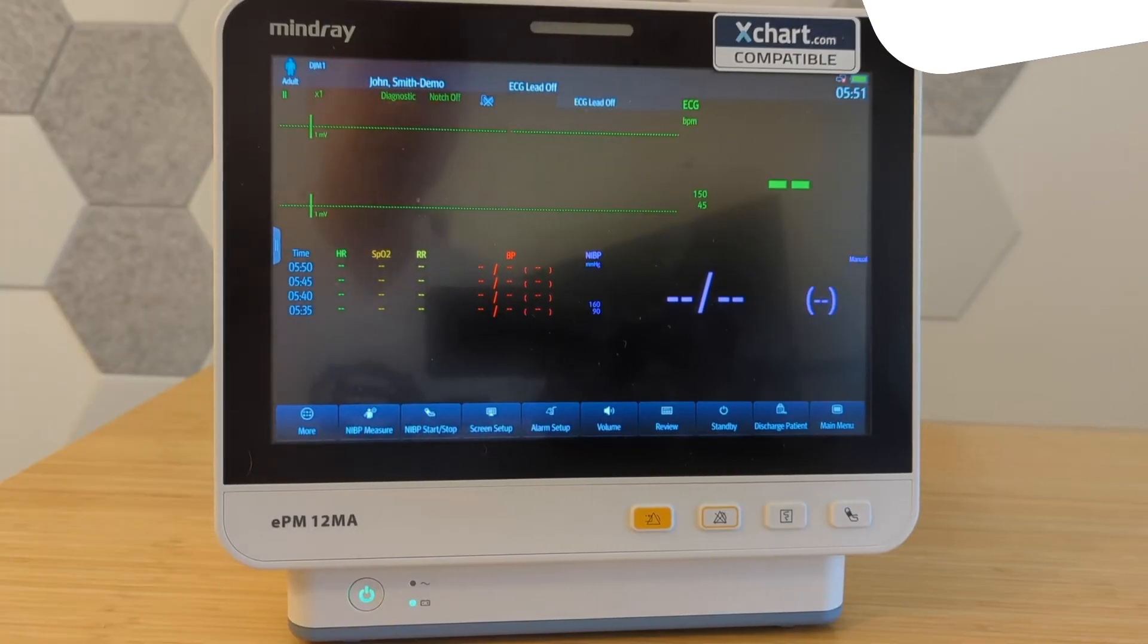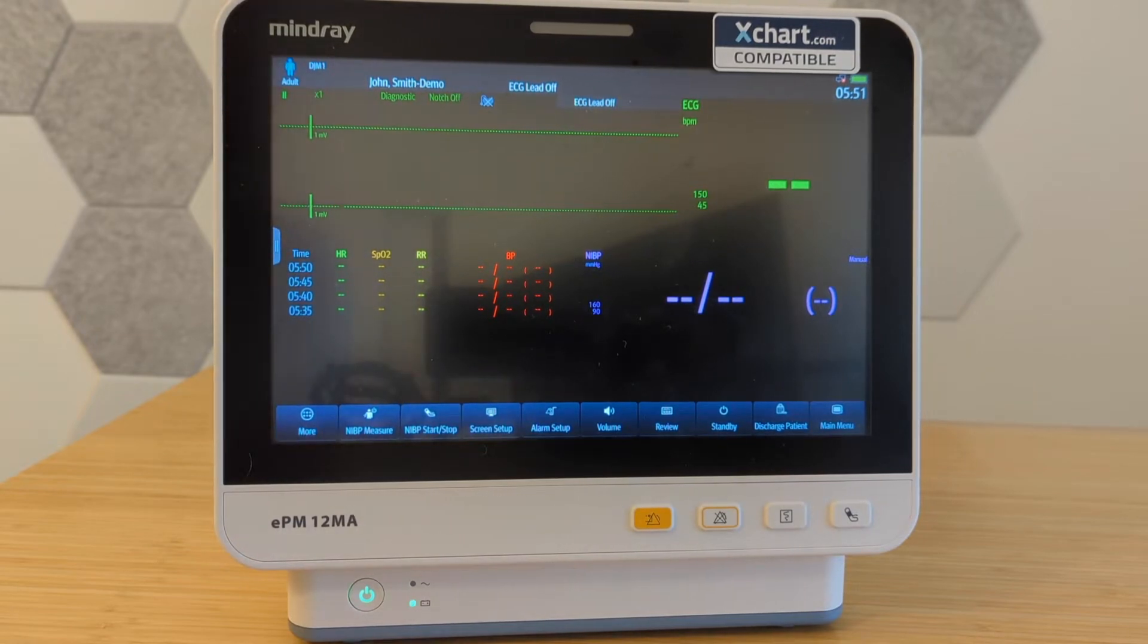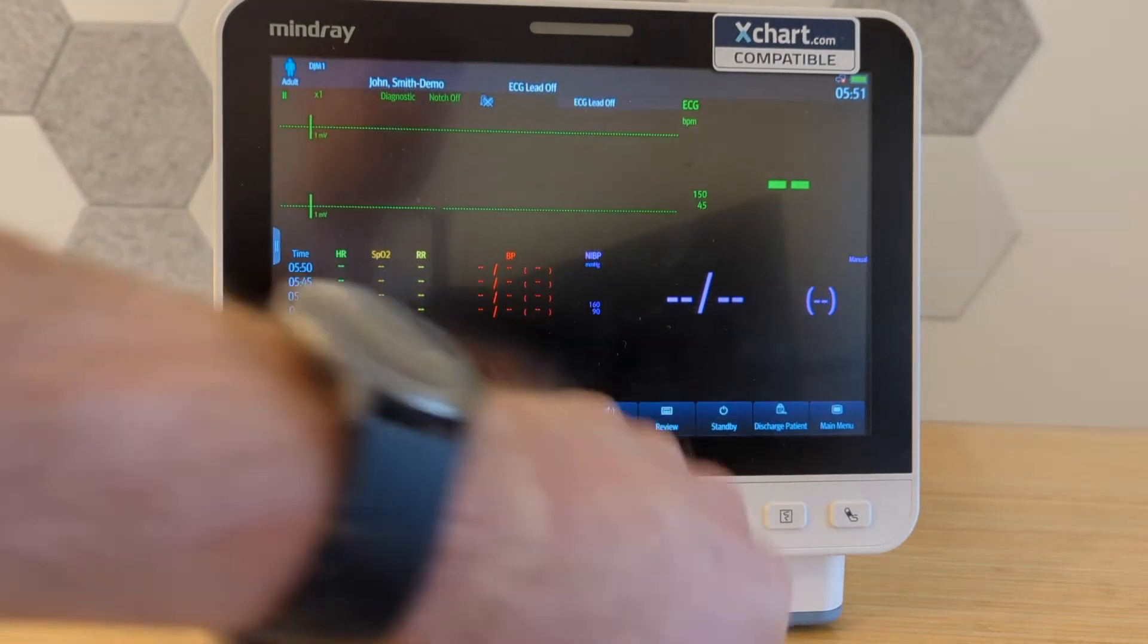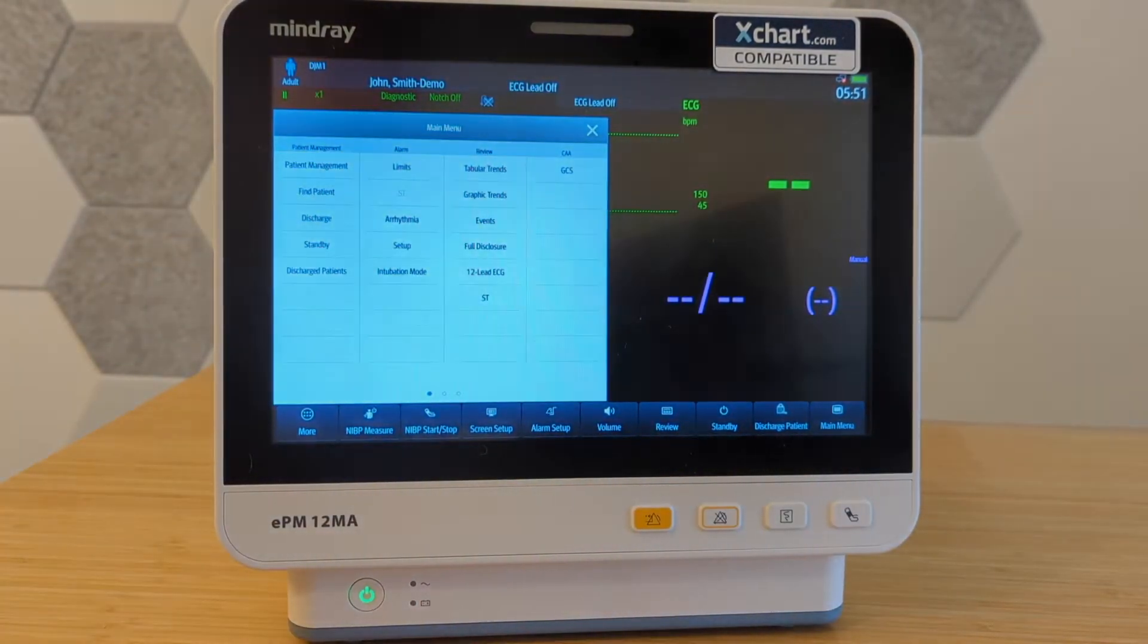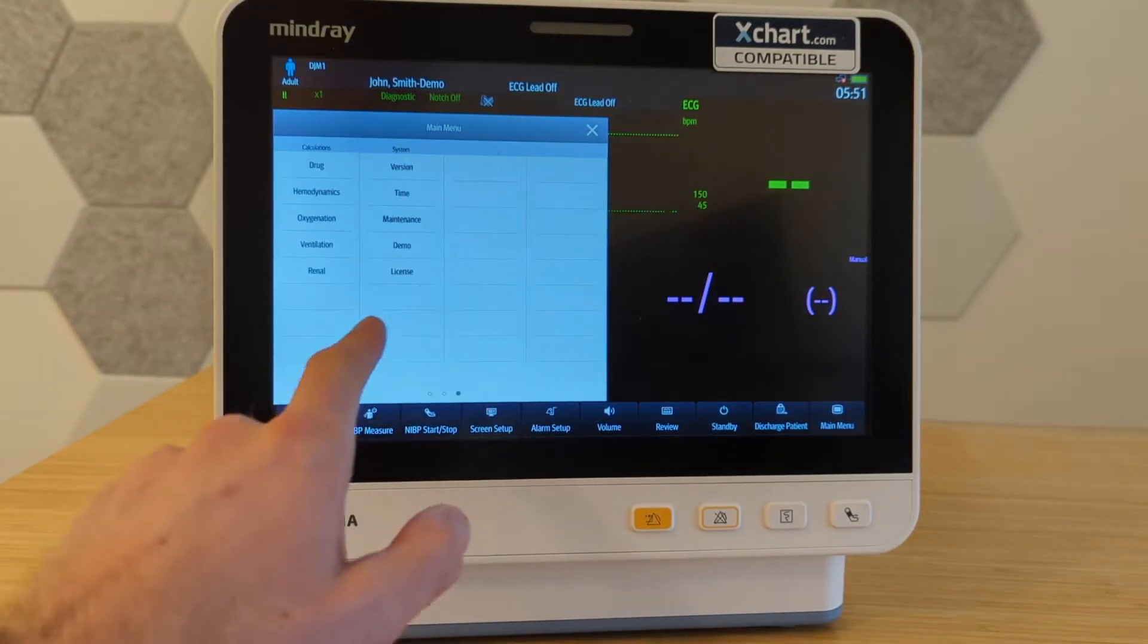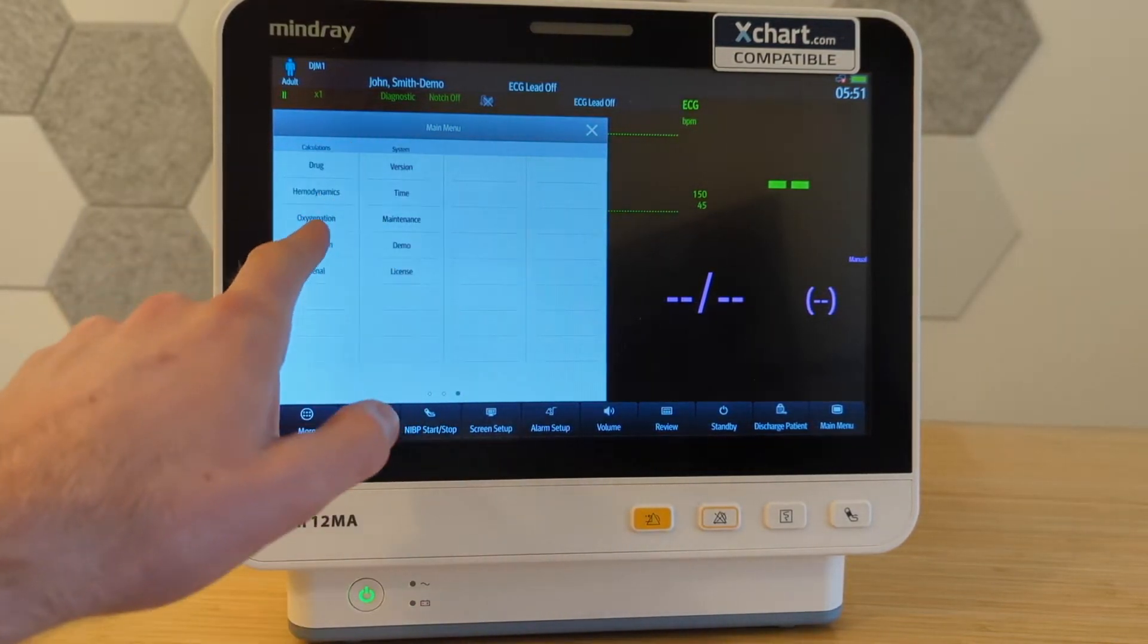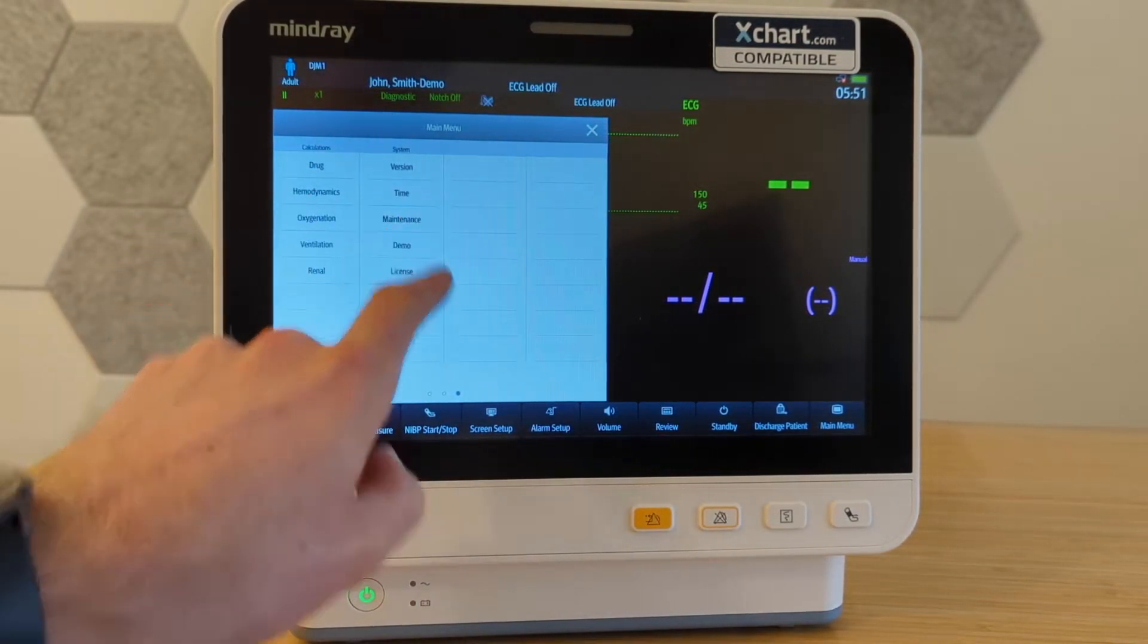Today I'm going to show you how to configure a Mindray EPM series monitor to be able to talk to xchart.com. First thing you need to do is go to the main menu over here and we're going to scroll over until we get to system and select maintenance.